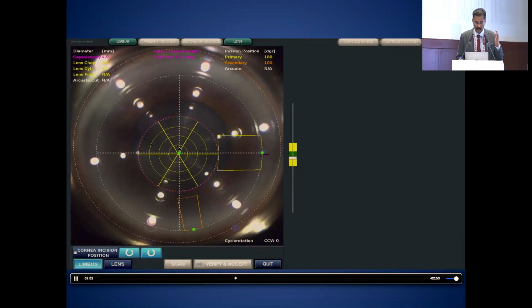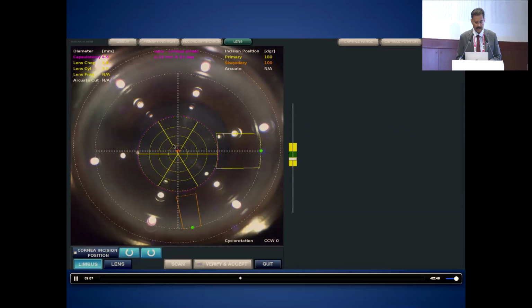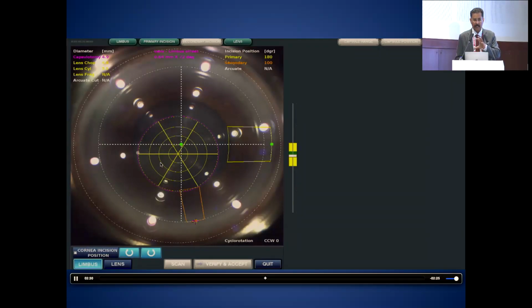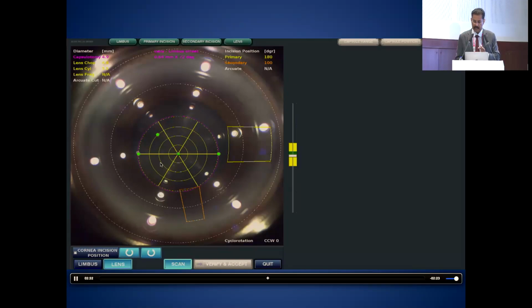It can be cylindrical, it can be horizontal cuts, multiple cuts, you can number them, and adjust the location of the incisions also. Better be clear corneal, because it doesn't go through hazy cornea, or large arcus, it doesn't cut, and towards the limbal area also it doesn't cut well, so be on the clear cornea. According to the pupil size, you can adjust the location of your rhexis, but once it has captured the limbus margin, it centers by itself.